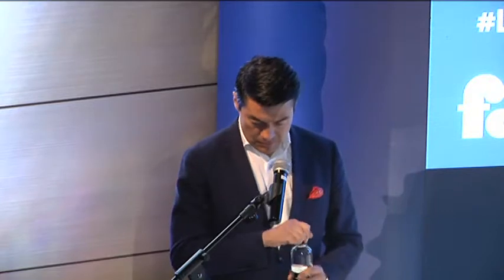Mapping. Luis, are you ready? Yes, good morning. From room 4 with Dr. Andrea, Natale, and Diego Rodriguez. We would like to present the case first.